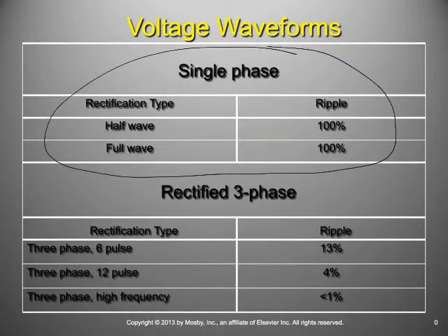So we will rectify it. We have a circuitry of diodes that we're going to run the power through on the kilovolt side. And it's going to flip it once, and then it's going to flip it again and flip it again. So what we get is something like this, right? When I turn it on, it's going to power up and then hit a point where it starts to rectify itself up at the top level, right? And so now I have a ripple.